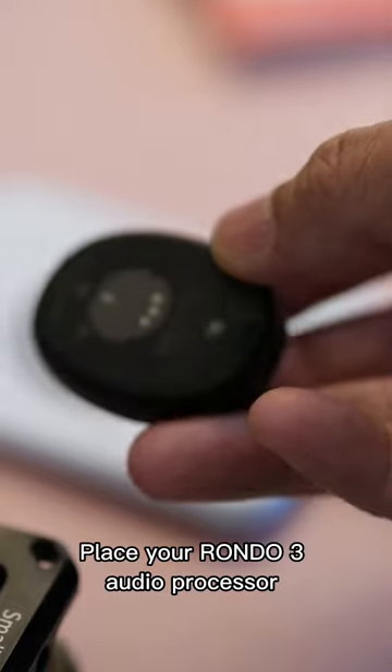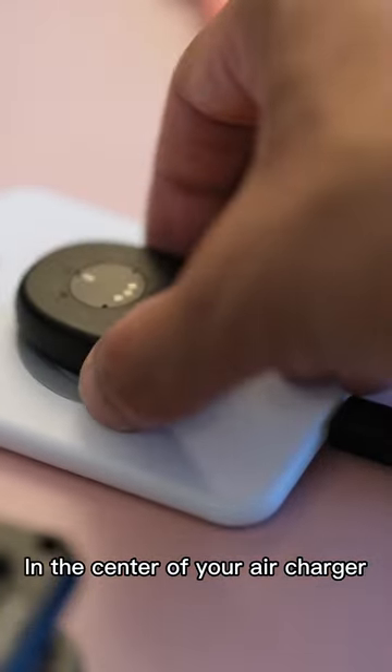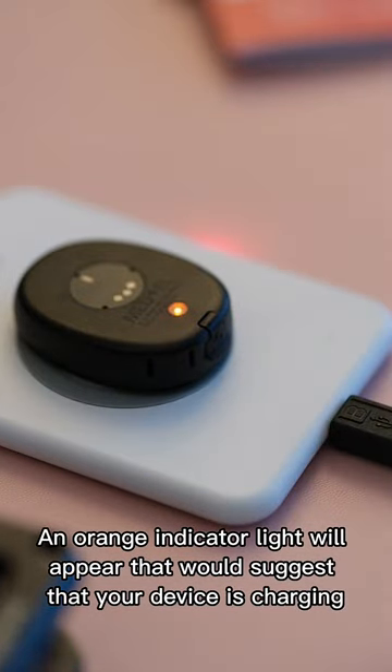Place your RONDO 3 Audio Processor in the center of your air charger. An orange indicator light will appear, which suggests that your device is charging.